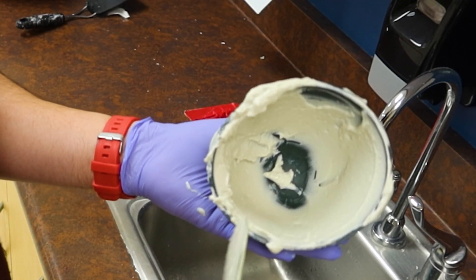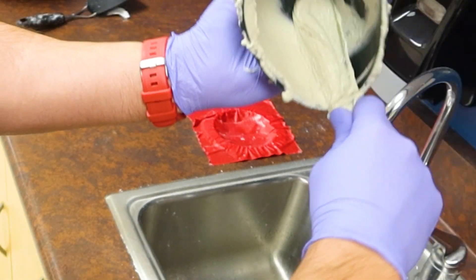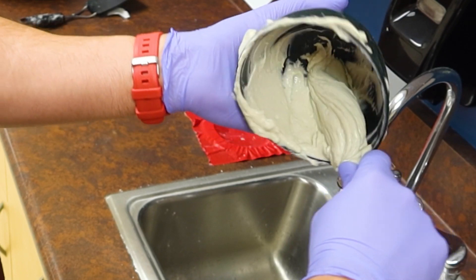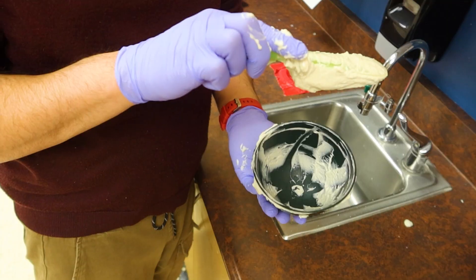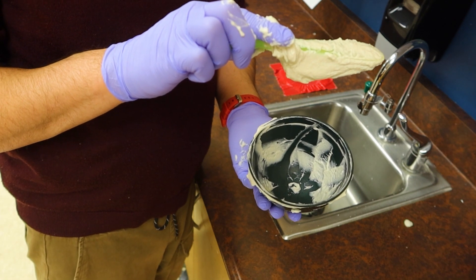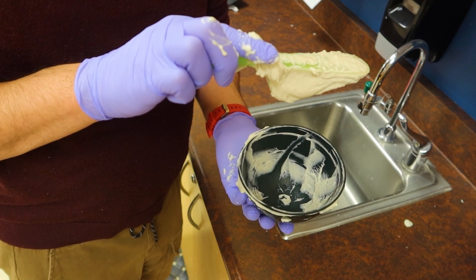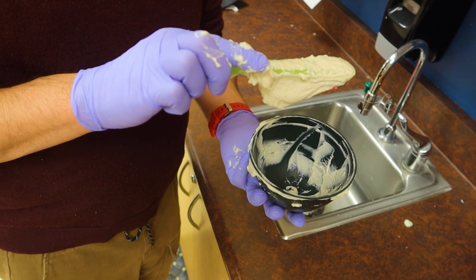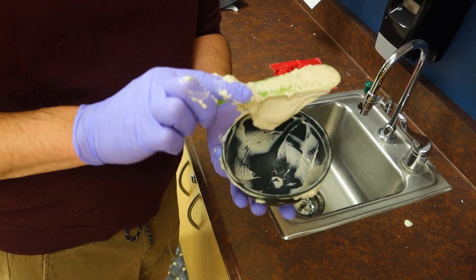After you get everything nice and mixed, run the spatula along all the walls and spin your bowl to get a good wad of material. It should be able to hold its form and just slightly droop — it doesn't run off your spatula, it holds its form for the most part. This is good for impression at the moment. Some people may adjust for their liking and style.